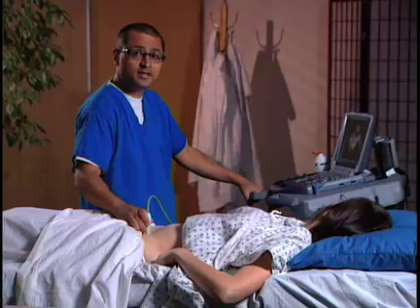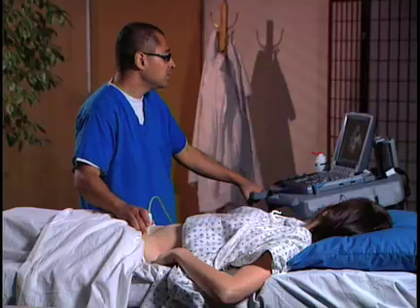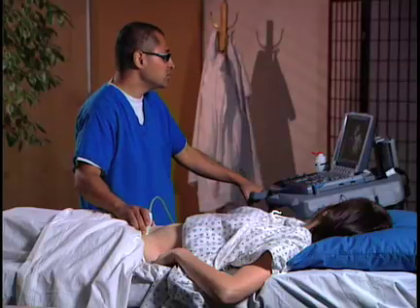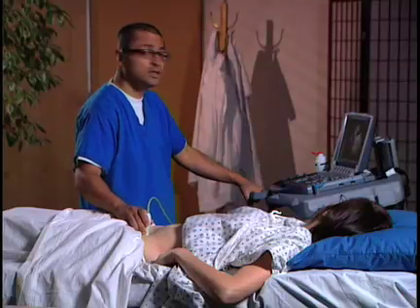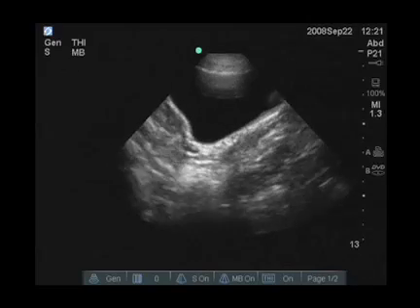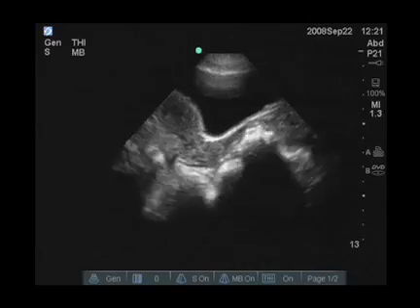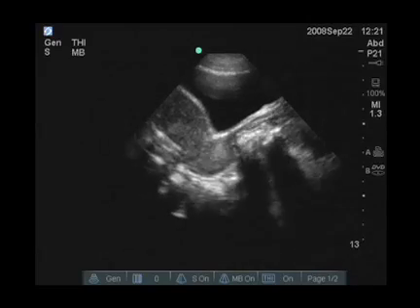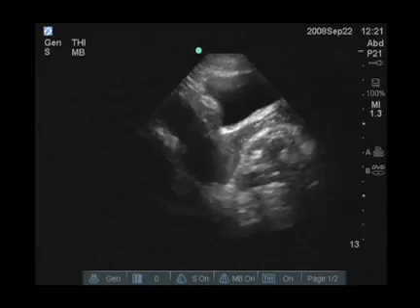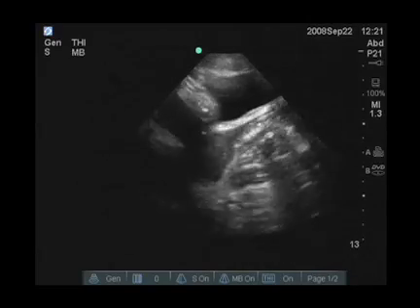When we scan this patient in a sagittal view, from the patient's left to the patient's right, we're slowly scanning to see if there's any evidence of free fluid.